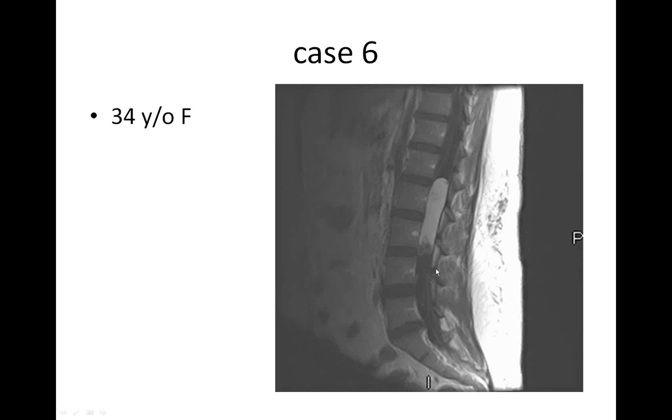On this side, we're seeing more bone, and then we got some muscle here. Those are back muscles, and then this is all subcutaneous fat tissue. This is fatty tissue underneath the skin. Here's the skin right here. So this is lumbar spine. This is the sacrum, and this is the tailbone right here.